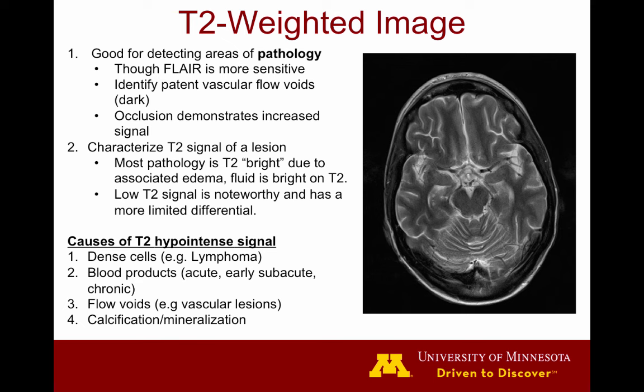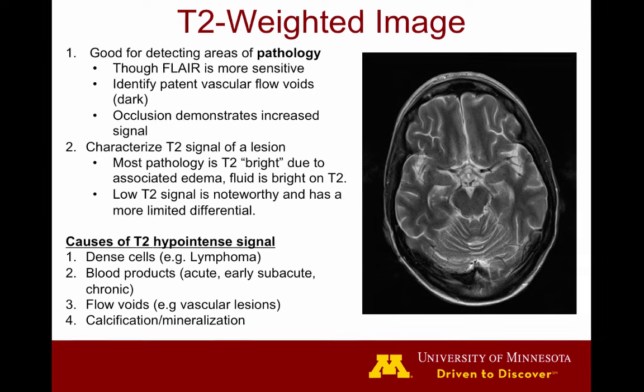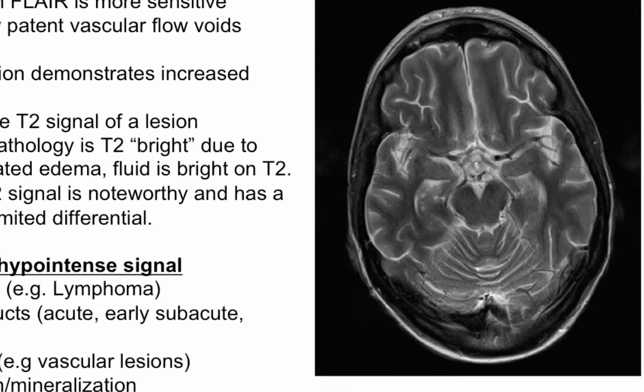Here we have another T2-weighted image slightly lower in the head. Recall that T2-weighted images being more sensitive to fluid will show edematous pathology as bright, a little more easily seen than on T1-weighted images. I want you to take note of the flow voids that you'll see here in the left middle cerebral artery, distal internal carotid arteries, and even the right posterior communicating artery.